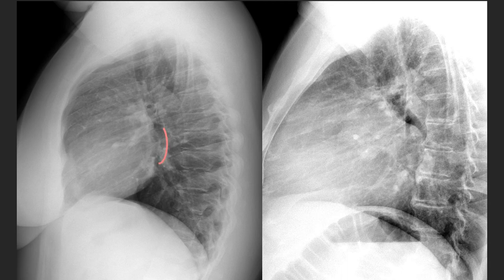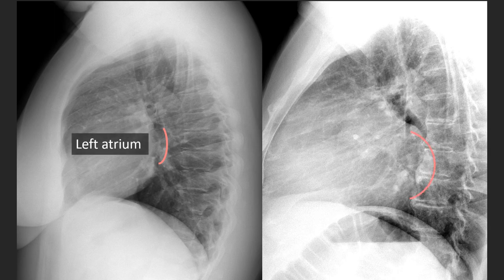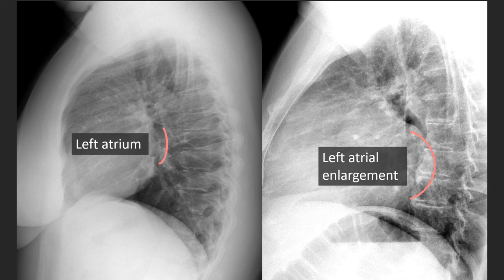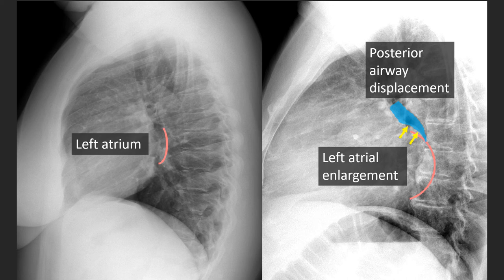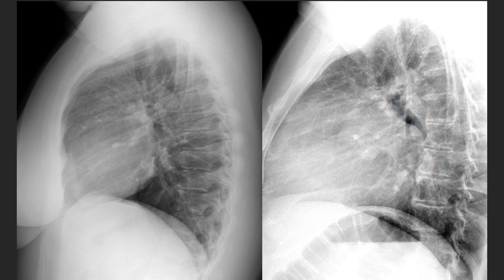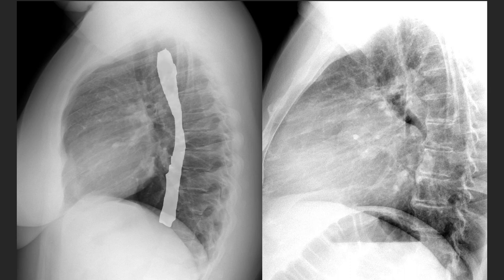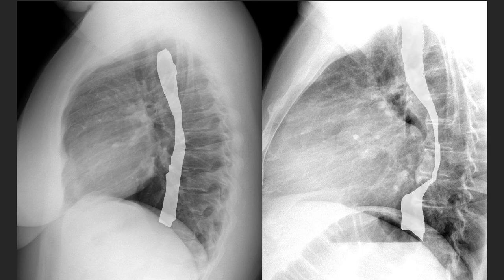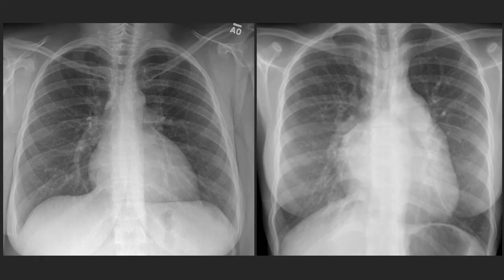On the lateral view, the left atrium represents the most superior and posterior aspect of the cardiac contour. When enlarged, it projects more posteriorly and can even overlap the spine, as noted on the right. Also notice the mass effect with upward and posterior displacement of the airways secondary to left atrial enlargement. Normally there is a minimal amount of mass effect on the esophagus, which can be observed on esophagram — notice the subtle indentation of the mid-esophagus on this normal person on the left. When the left atrium is enlarged, the mass effect on the esophagus can become quite accentuated, as we see here with significant extrinsic compression of the esophagus on the esophagram.